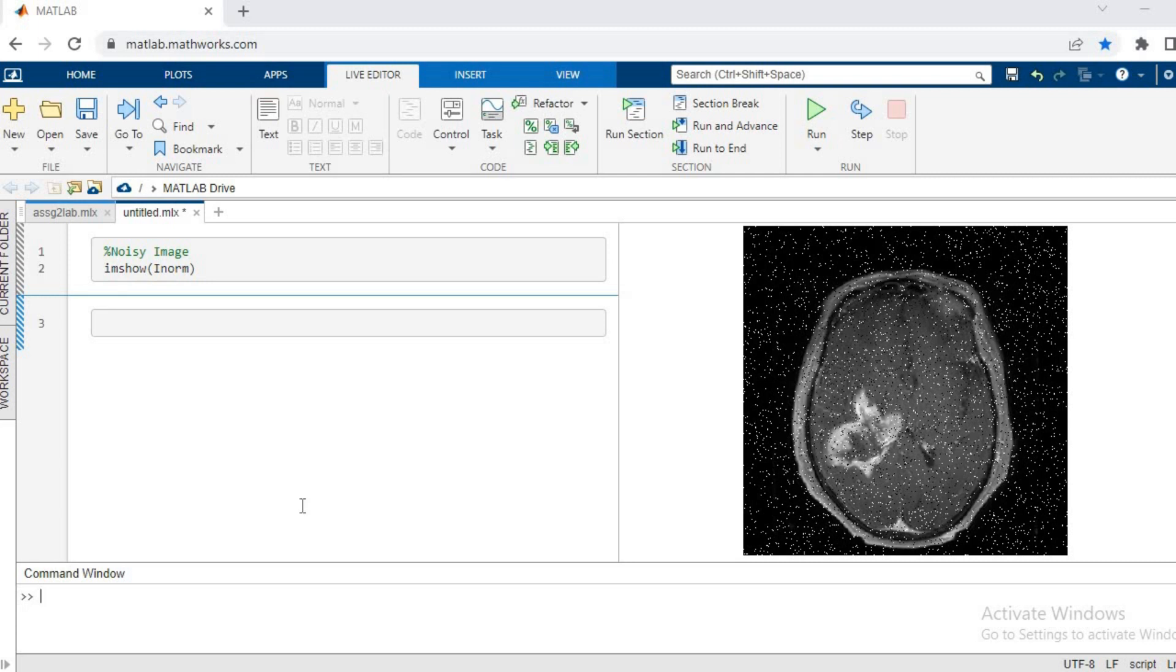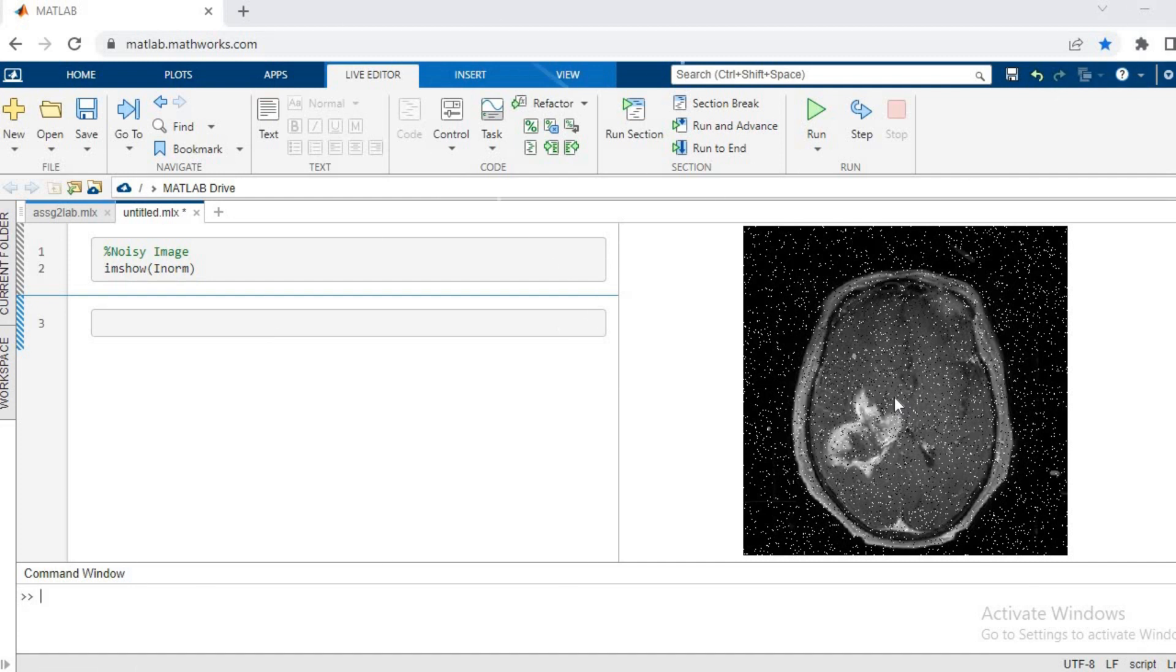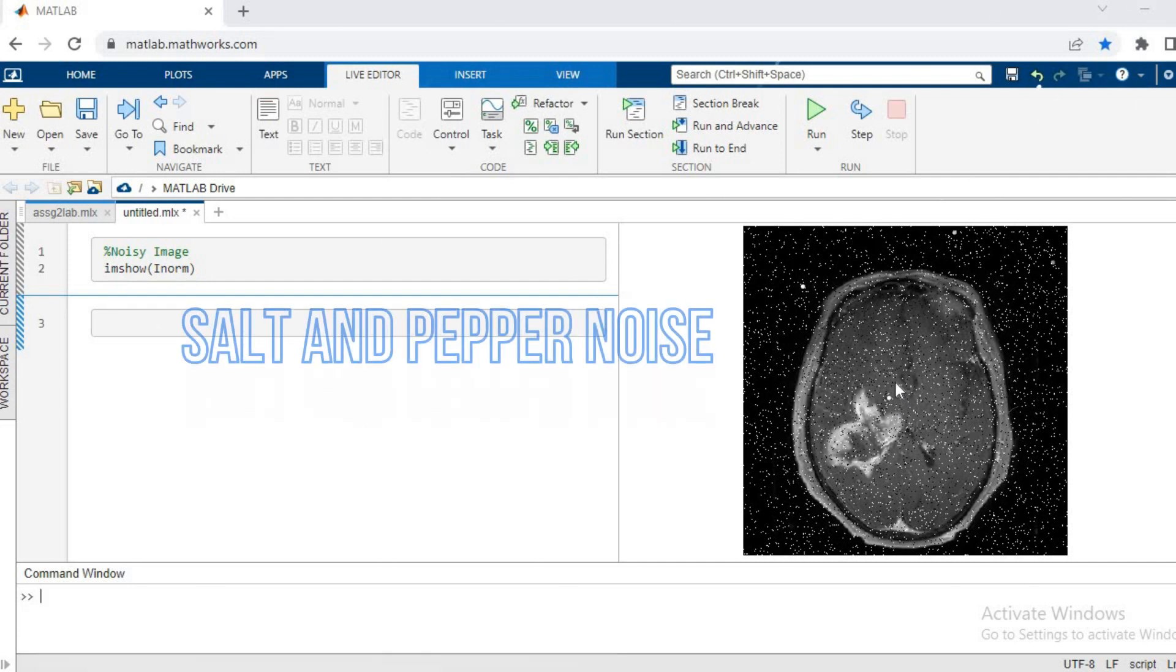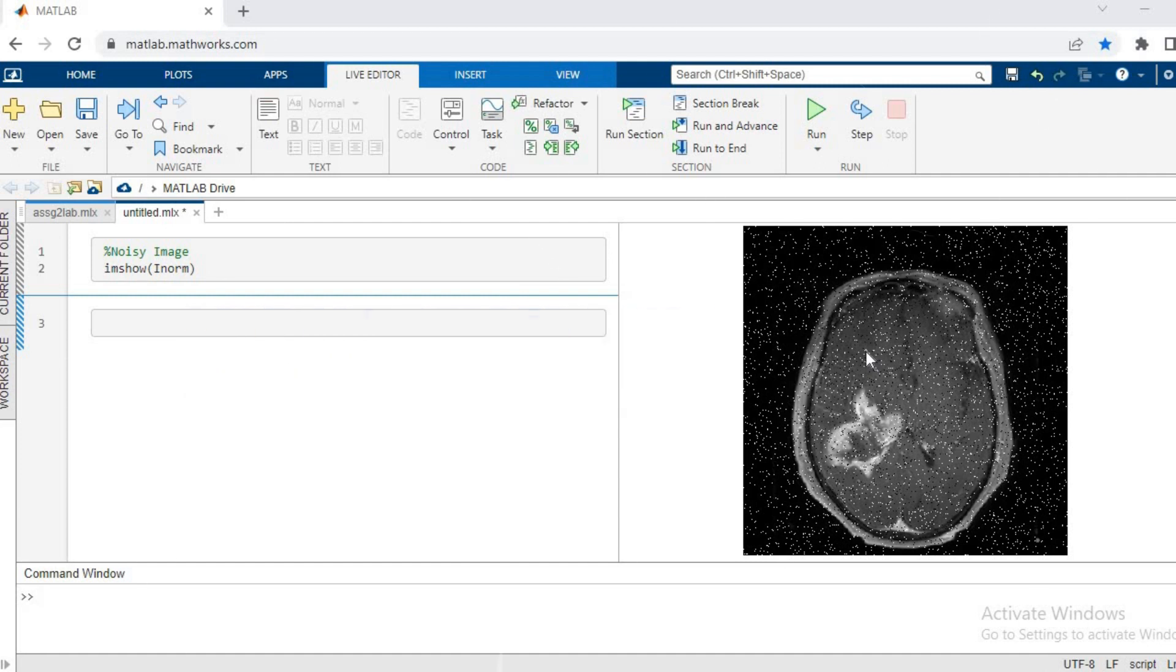Hi guys, welcome back to this tutorial. In this tutorial, we have a medical image in which we can see a lot of noise, and our aim is to remove all this noise. This kind of noise has a special name: it is called salt and pepper noise. The reason being, you can see white dots and black dots simultaneously.